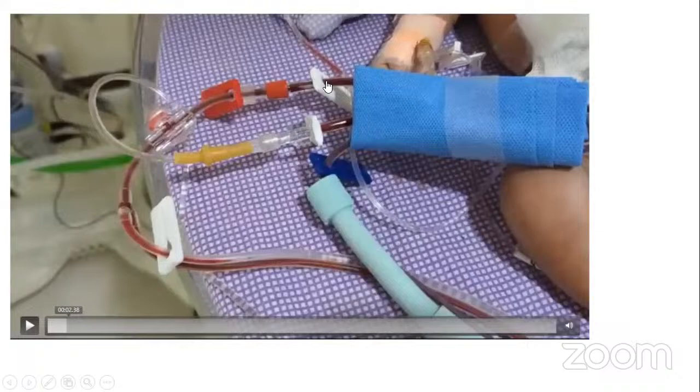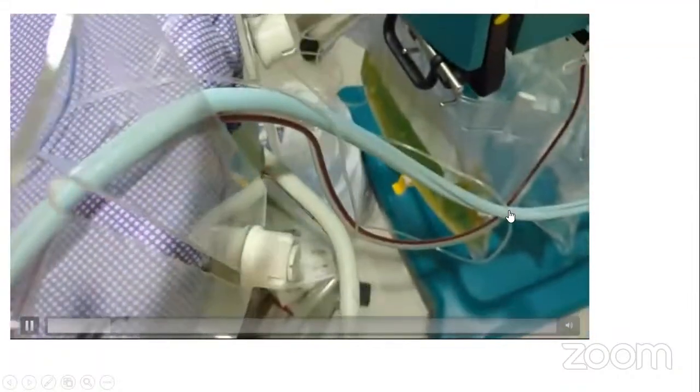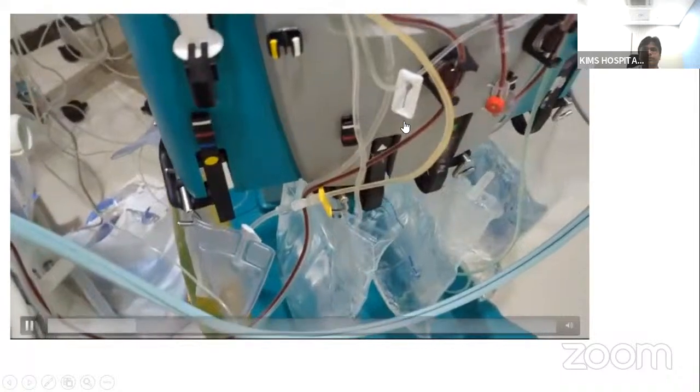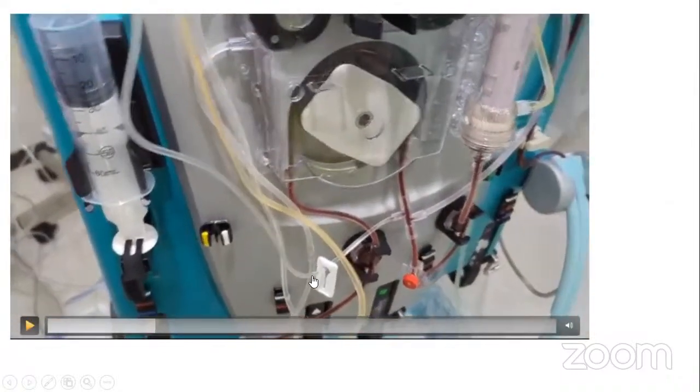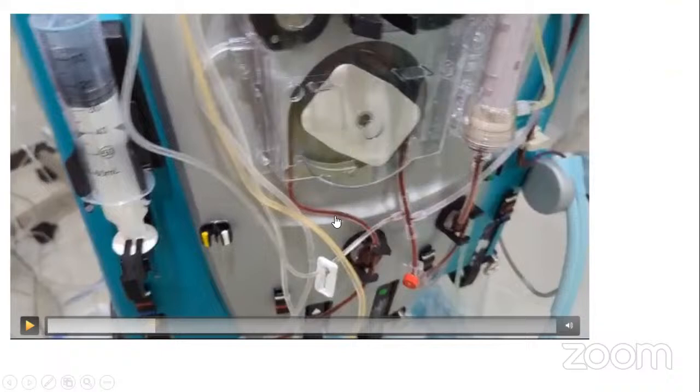Here we can see blood is drawn from the patient. Here we can see these two tubes. Remember these two tubes; I will come to why they are there in the following slides. The blood is drawn and through this circuit, almost 150 centimeters, it enters into the machine. Once the blood is drawn, it passes through the access pressure sensor. After this is the blood pump. This pump helps in pulling the blood from the patient, and how much pressure is required for pulling the blood is determined by this access pressure.